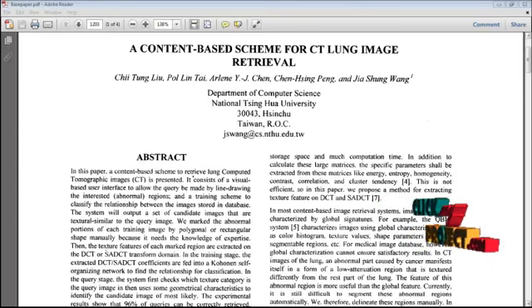In the retrieval module, we merge clusters from the same relevance class using a minimum distance criteria. This process is repeated until the number of remaining clusters become relevant to the image categories in the retrieved window, and the system will output a set of candidate images that are similar to the query image.